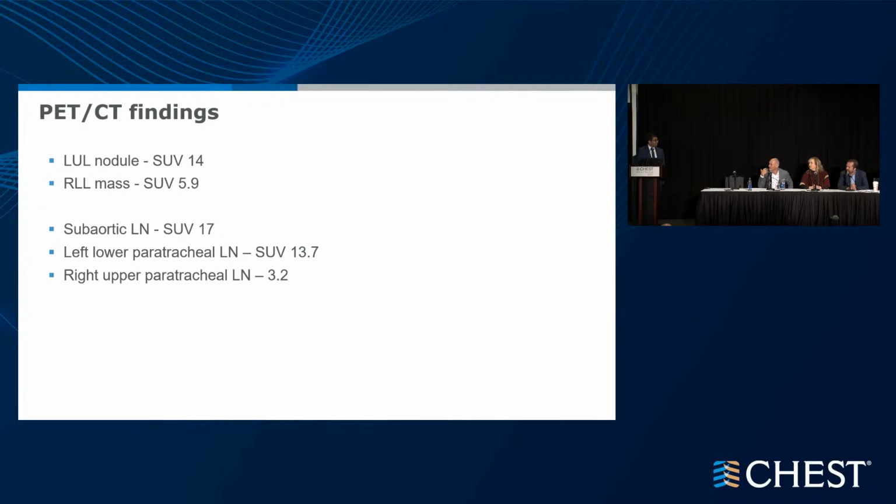This is tough. And it's also curious just the variation in the SUV avidity, because it also goes to your point, Rob, about the morphologies not looking the same in the primary lesions as the lung lesions. And so it really paints a picture where you have a lot to prove.